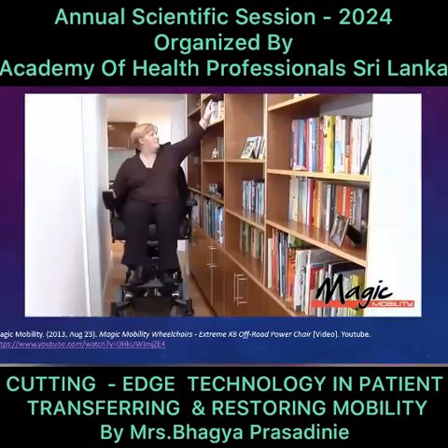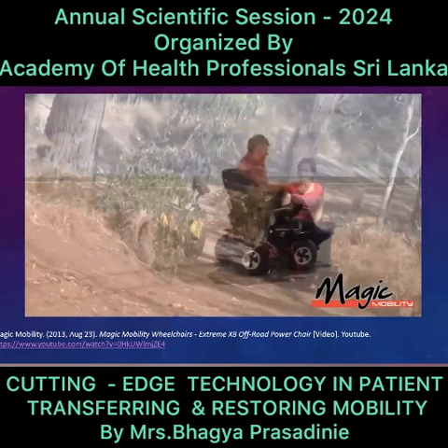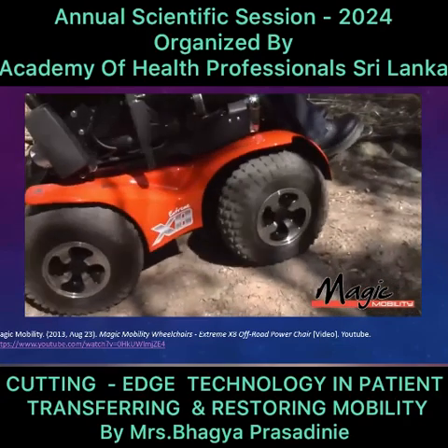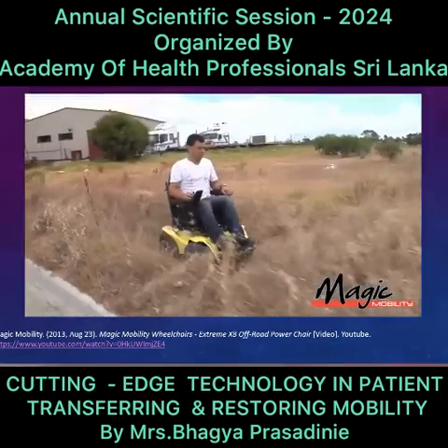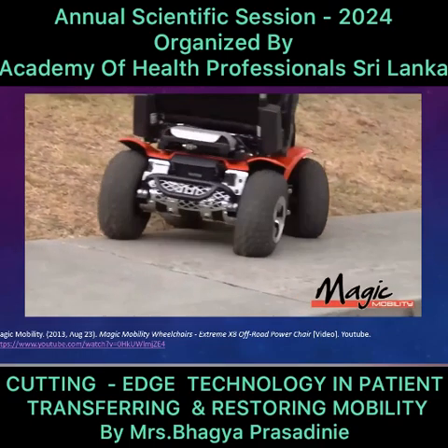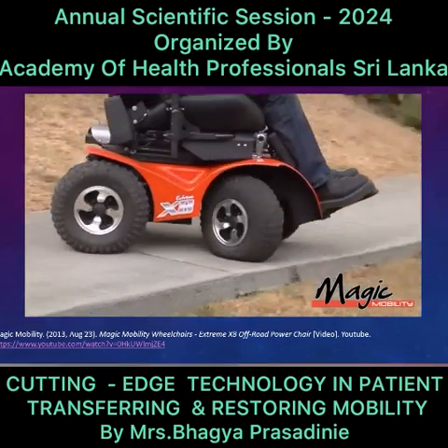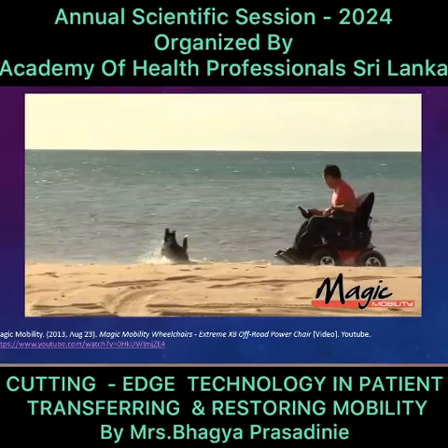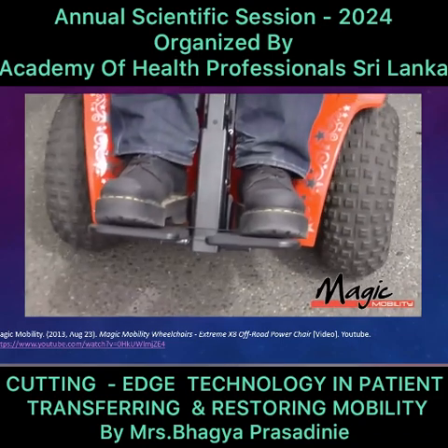You can lift the chair as well if you want to. And see, for a person who cannot be mobile, having this sort of mobility device allows the patient to travel to anywhere he or she wants.